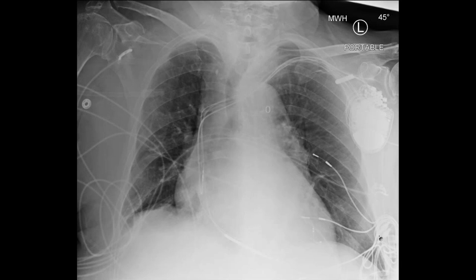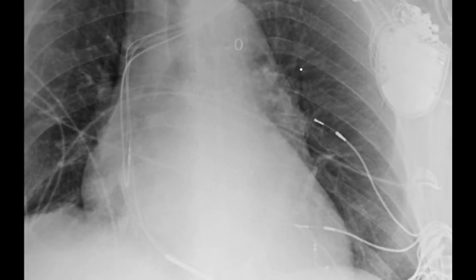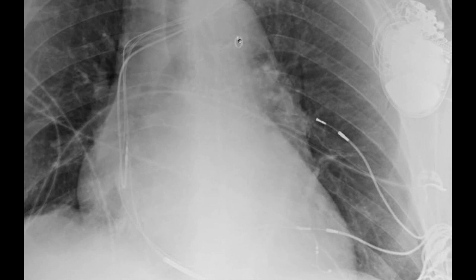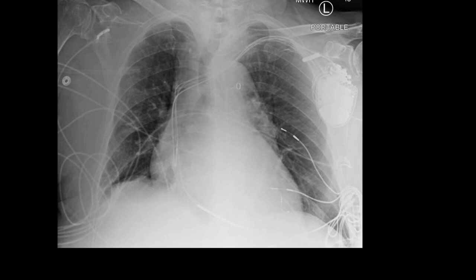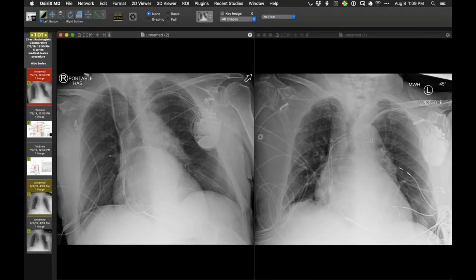And what we have new is some subcutaneous leads. We have another lead with a little bullet-shaped object over here. And we also have a small radio opaque ring in that location. I will mag this up now to show you that inferior to the radio opaque ring is a balloon containing gas, which is right there. So we have an assist device that's associated with a balloon in the distal aortic arch and descending aorta, associated with some other items. So this is an investigational counterpulsation device.